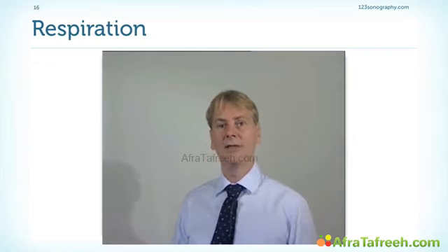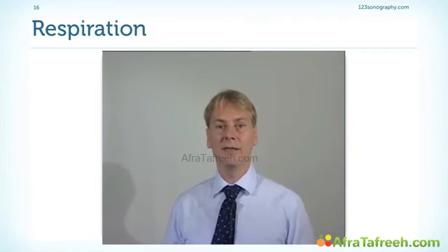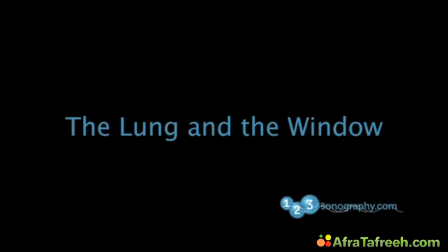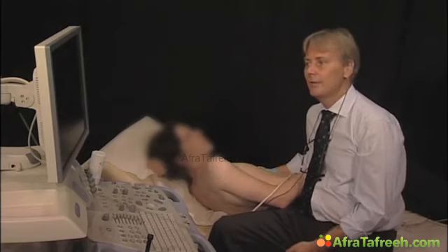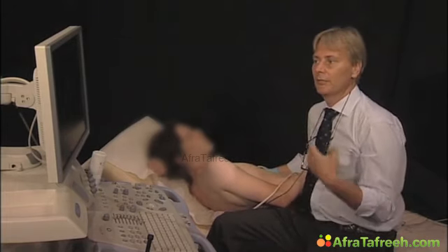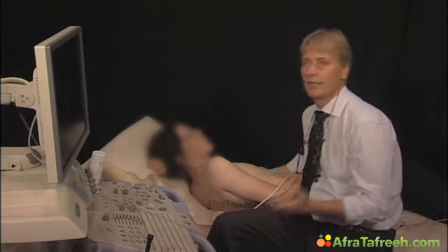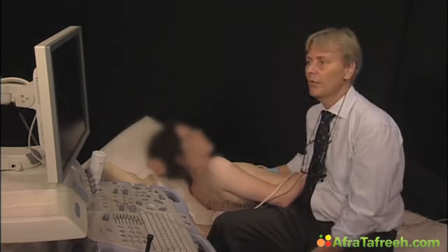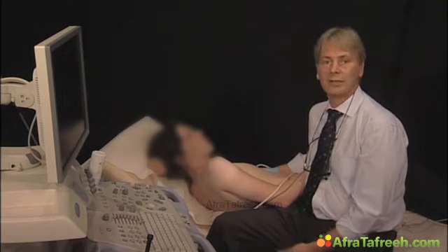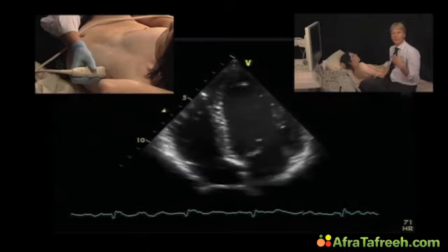So it's obviously a difference if the patient inhales or exhales. Let's take a look at what happens if the patient breathes. The lung has a very big impact on the quality of the images, simply because we cannot image through air, and if the patient inhales or exhales, we will change the windows and thereby change the quality of the echocardiogram. So I will show you what happens when a patient inhales.